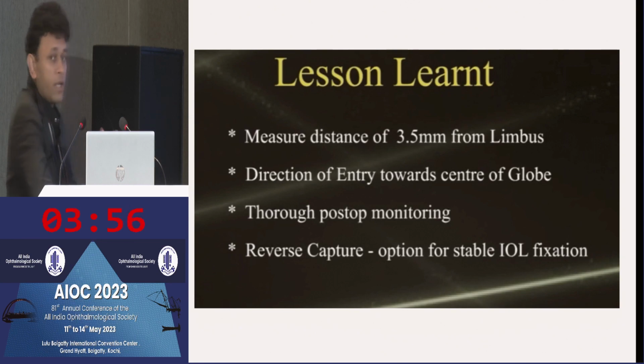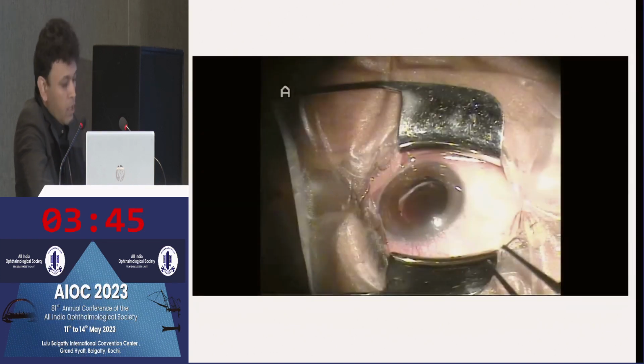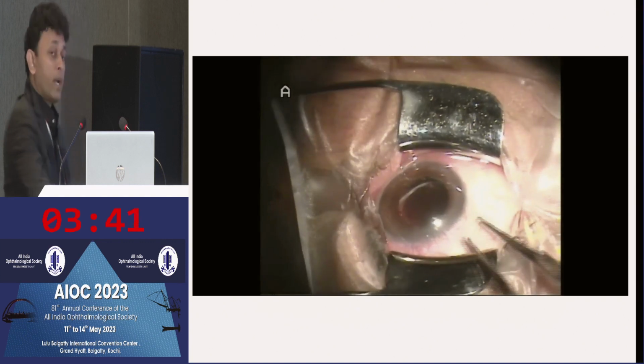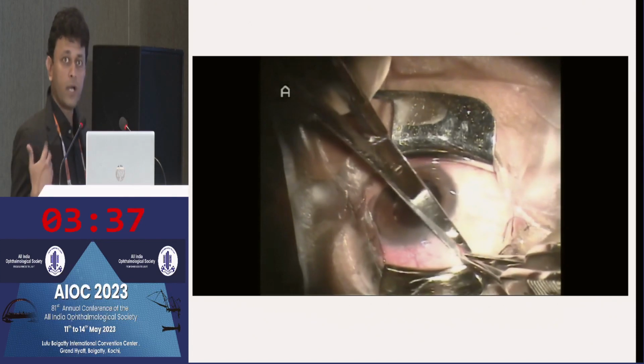But this is not everybody's piece of cake, which is why the position of the implant, or the position of the applicator needle, is extremely important while injecting. The third option, especially in a country like India, is triamcinolone. But the problem with triamcinolone is its high propensity to cause IOP spikes.